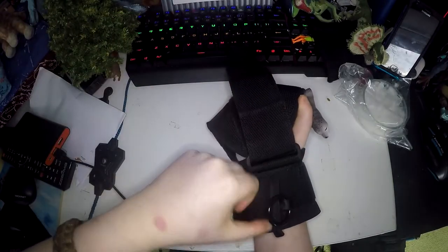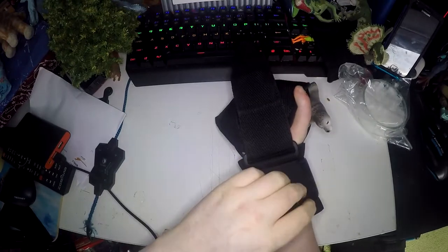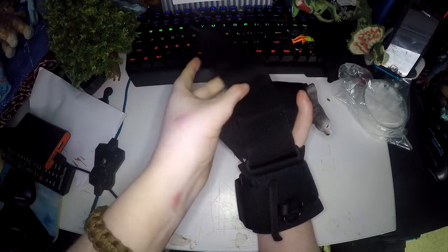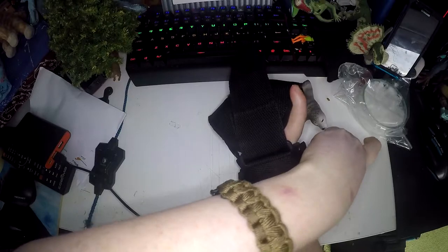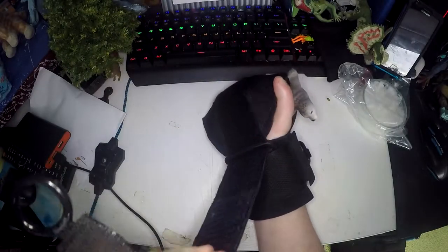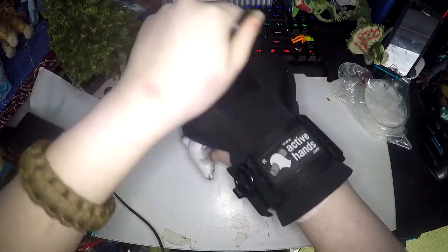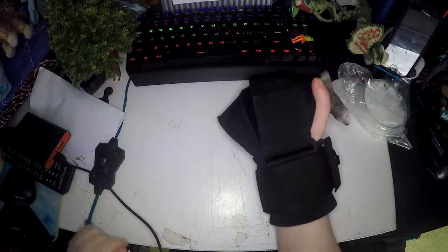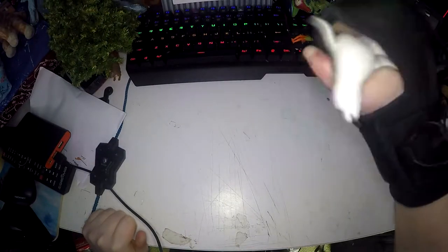I have problems with my thumb so it doesn't work properly on me, but you pull that tight so it closes your hand. Now you can readjust the bottom one so it's nice and tight around your wrist, then tighten that again. It wraps over the top of your hand and that will keep your hand completely shut — there's no way you will drop what you're trying to hold.